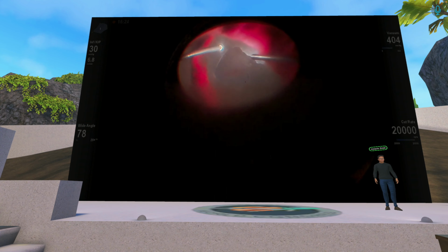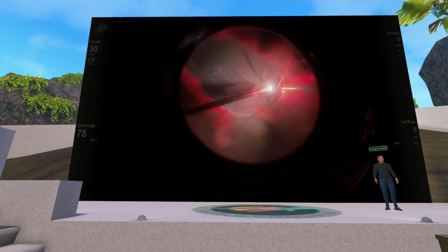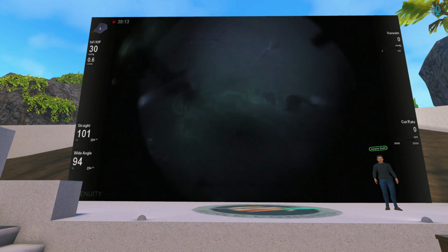We proceeded to trim that membrane down very, very carefully and proceeded to do Intraoperative. And as you will notice very soon, you can clearly see the ischemic areas in all the inferior and temporal quadrant. That's my favorite filter of all.